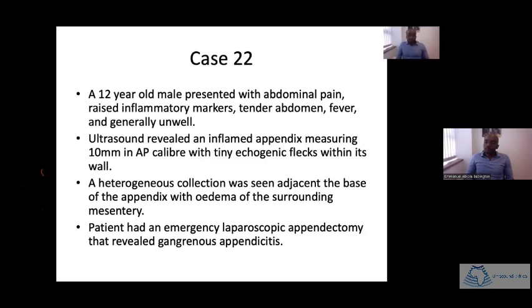The parents were worried. So we did an ultrasound on this patient and found a 10 millimeter inflamed appendix with echogenic foci within the wall. A heterogeneous collection was seen at the base of the appendix with some edema surrounding the mesentery. The patient had an emergency laparoscopic appendectomy, which revealed a gangrenous appendicitis.